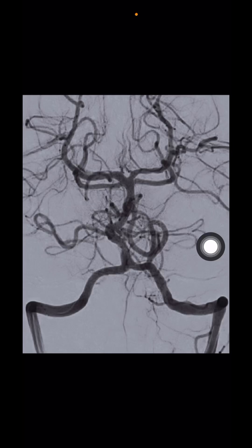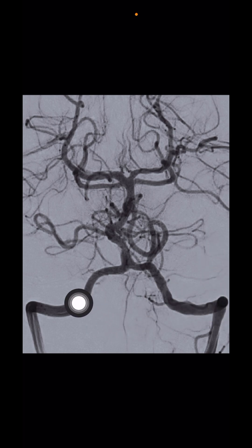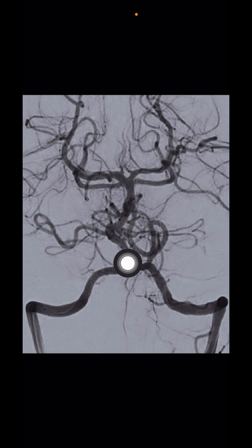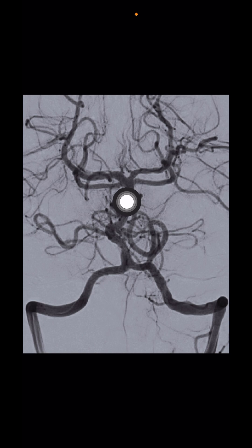Looking at this much more clear angiogram, you can identify a few important structures, starting with the vertebral artery on both sides, joining together to form the basilar artery, which continues and forms two terminal branches at the end.